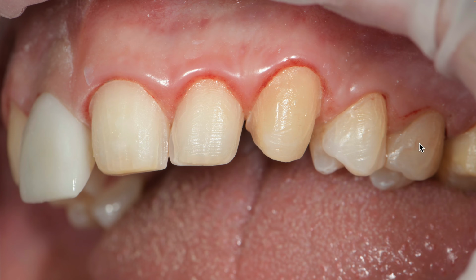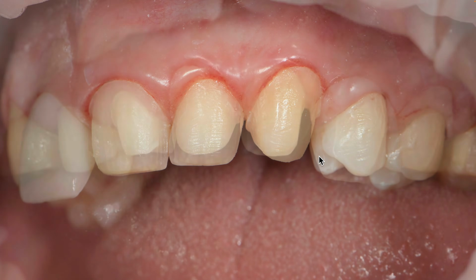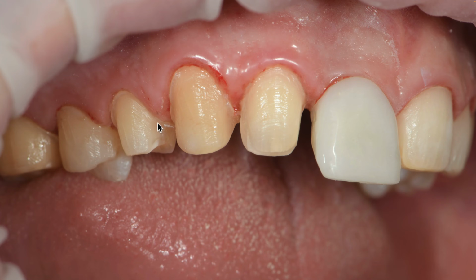And then these veneers are all enamel and basically wrapping onto the occlusal because we're opening the vertical, so we're overlaying the bicuspids, but it's a really conservative prep design. So it's interesting for you to see. That's why I wanted to show these. Same with on this side. So this is a conservative jacket crown prep design or glove crown prep design for these two, but this is a very conservative onlay veneer prep design.